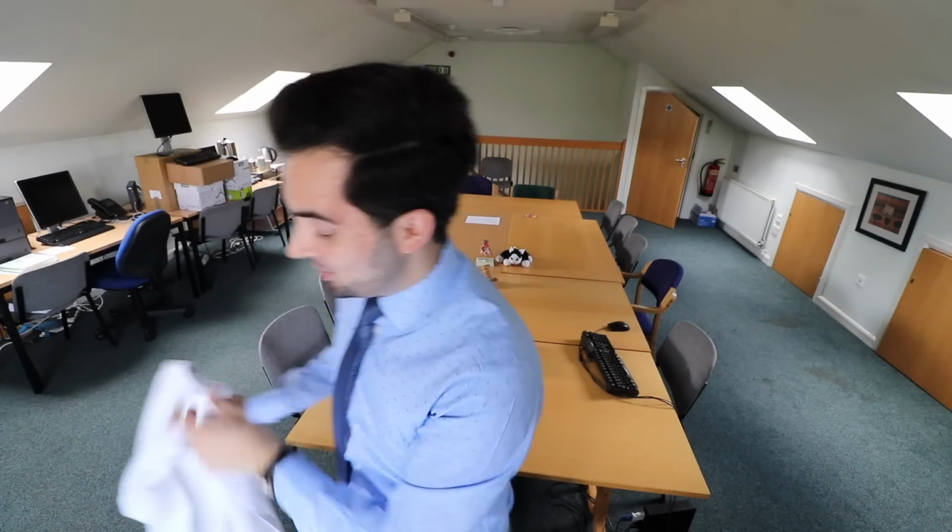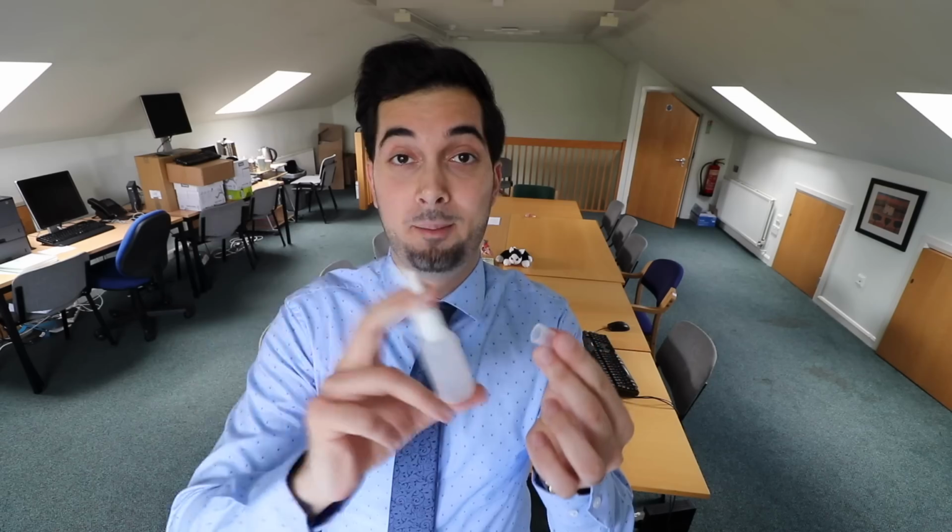So the first thing that you need to do is blow your nose, then shake your nasal spray and remove the dust cap. Now let's observe how it's done, but make sure you watch the full video because I'm going to show you common mistakes which many patients make which you can avoid.